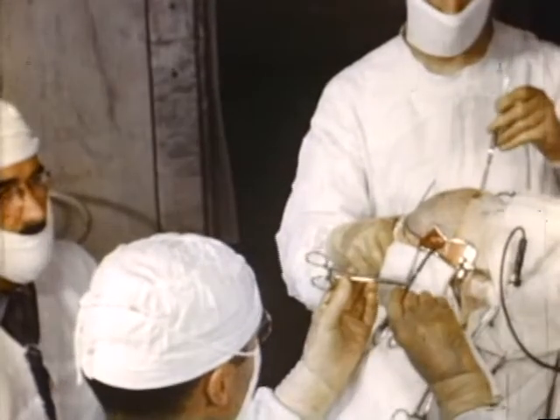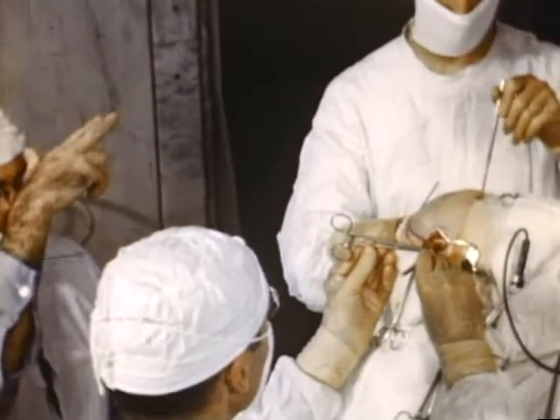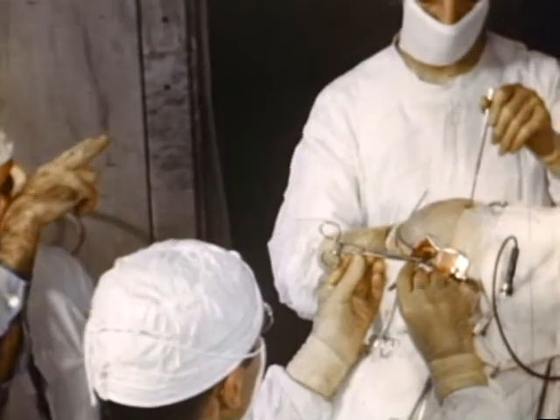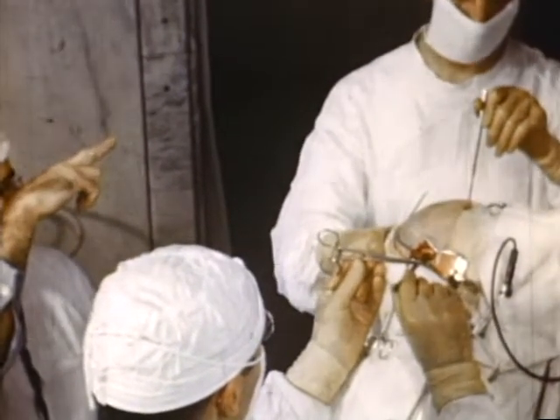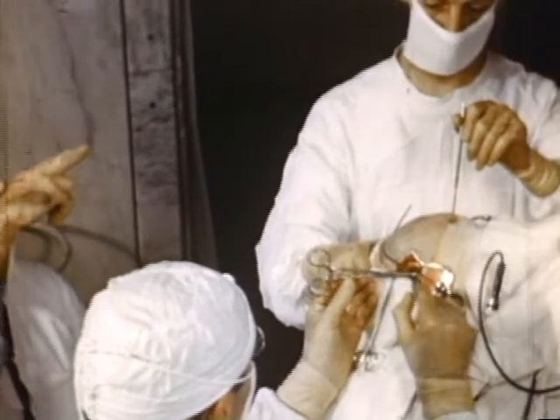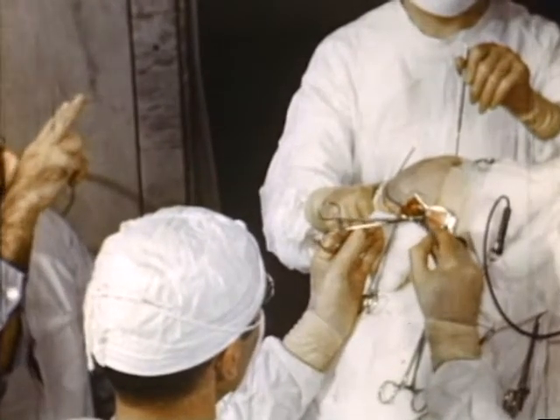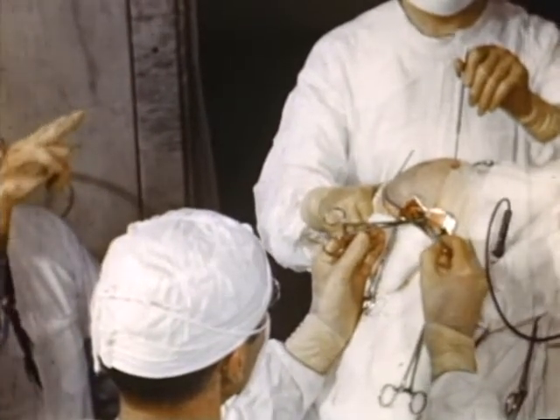The surgeon then clamps a hemostat on the blunt dissector, introduces it into the incision, and cuts to within 1 centimeter of the midline. The surgeon must be careful to avoid the anterior cerebral artery, laceration of which will lead to serious bleeding. He must also remain in front of the anterior perforated space with its many penetrating vessels.